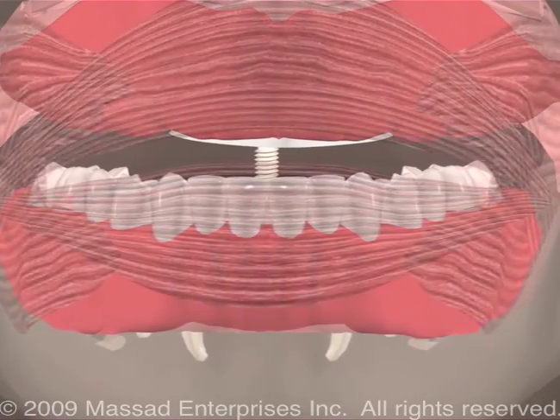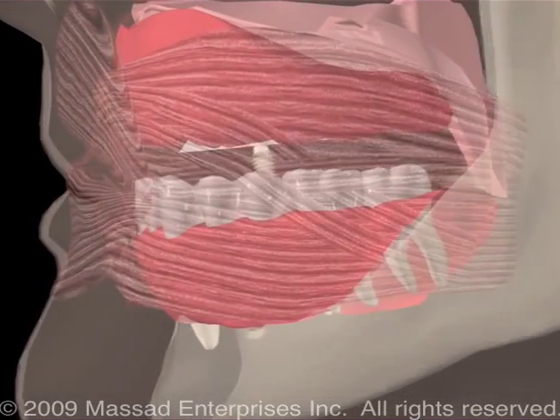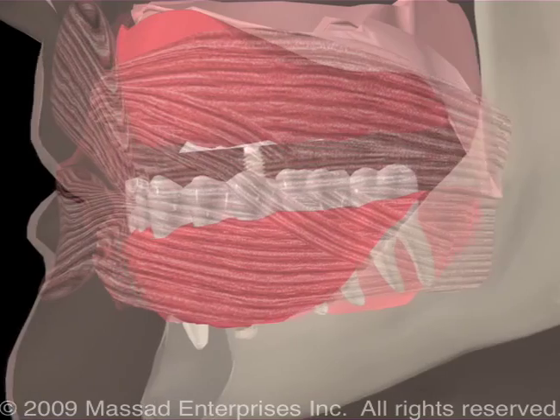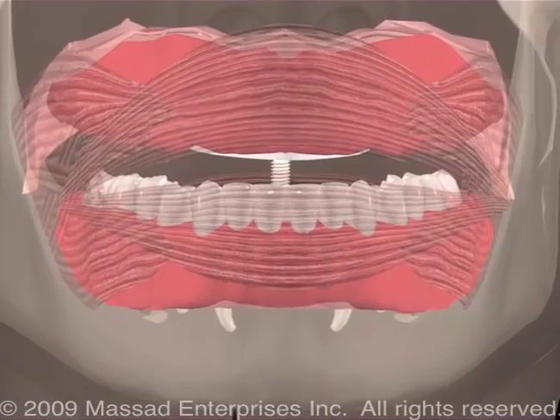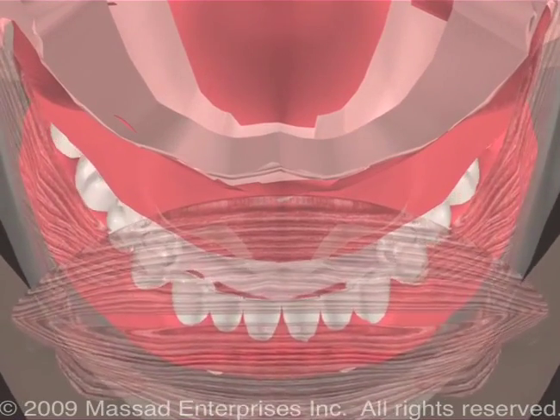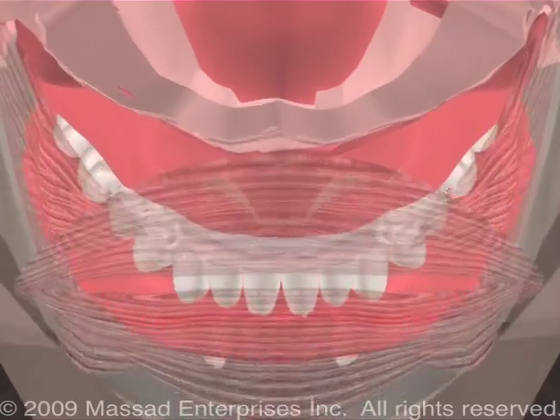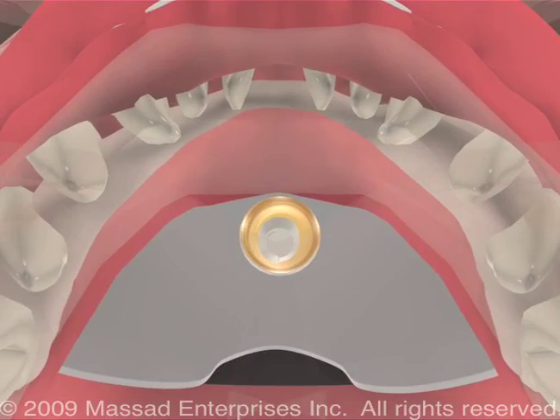The patient is instructed to repeat several times until the practitioner observes a smooth motion of the mandible, moving in all directions, forward, back, side to side. The practitioner can easily observe the patient for ease of movement. During this process, those patients who have difficulty in moving their jaws should have the ability to become deprogrammed. We suggest that the patient continue this process until a clear arrow is demonstrated.